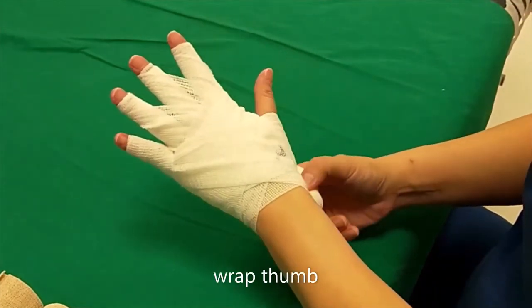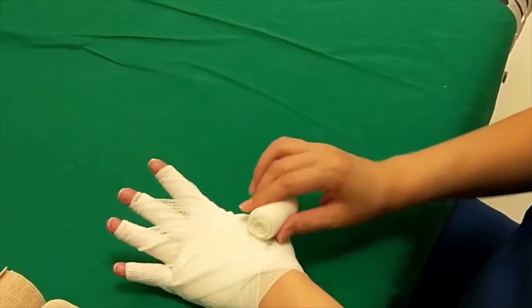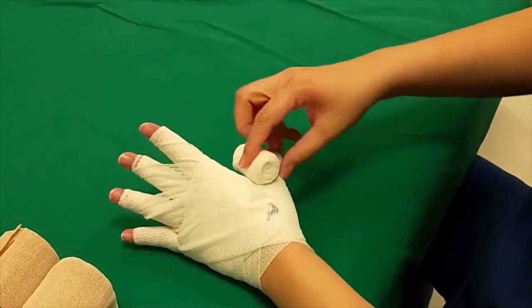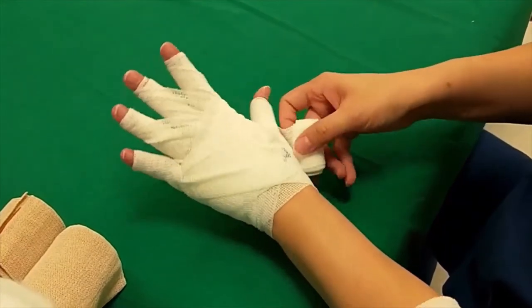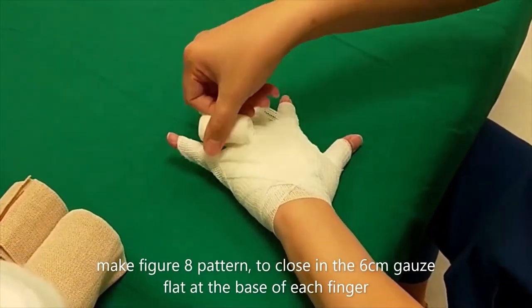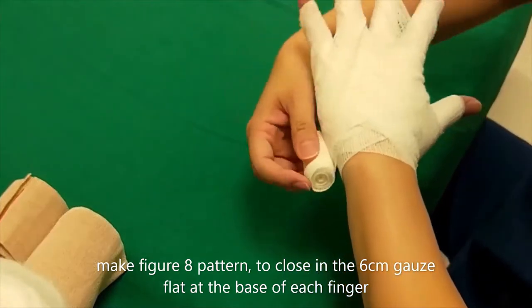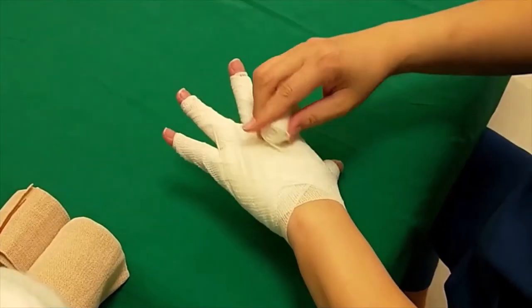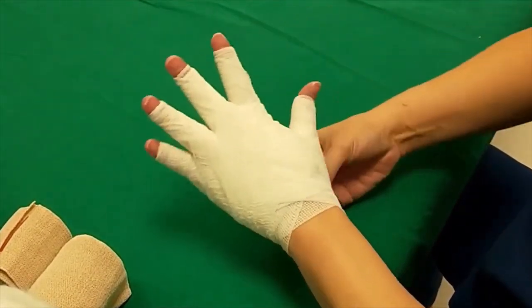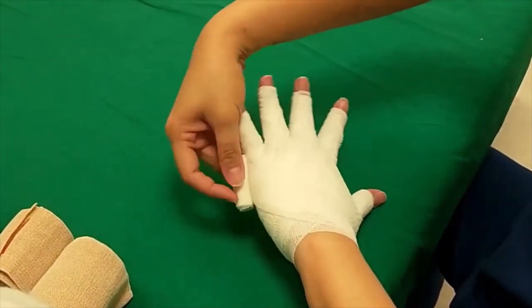Then move on to the thumb. Make a figure-8 pattern to close in the 6cm gauze flat at the base of each finger, wrapping the gauze in the same manner before going to the next finger.